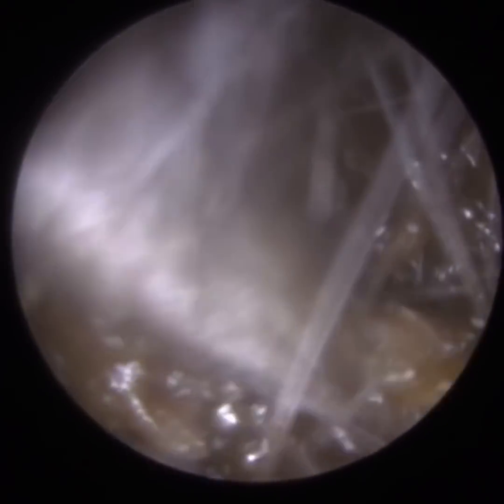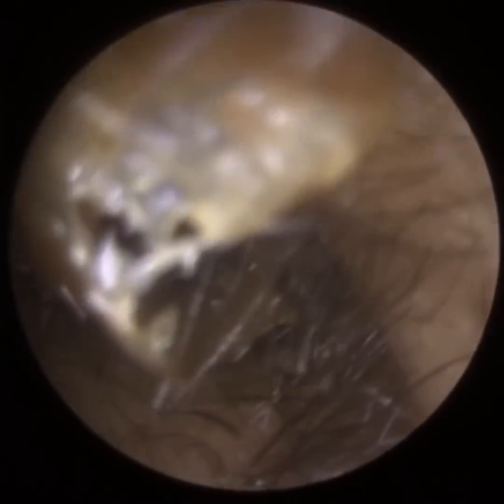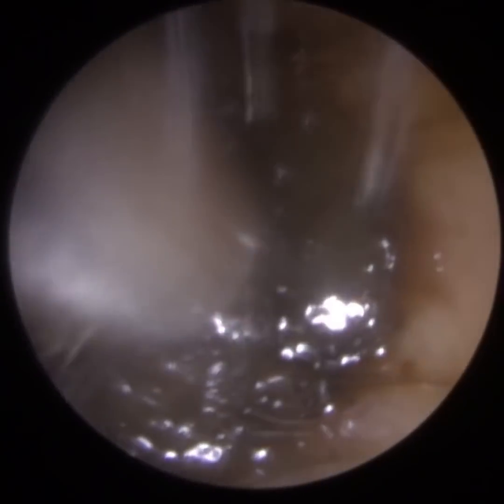This is the patient's left ear. You can see the cilia, so we know we're at the entrance or near the entrance. This is some dead keratin that's enveloped around the plug of wax — I've just removed that. You can see a tail of keratin there, from the anterior canal wall on the left-hand side.